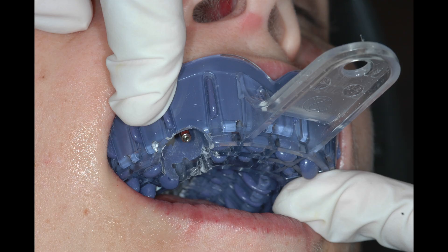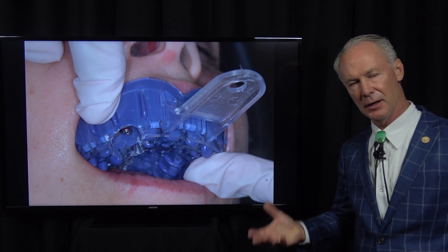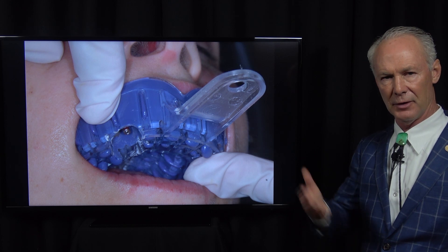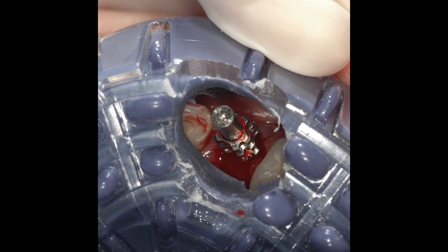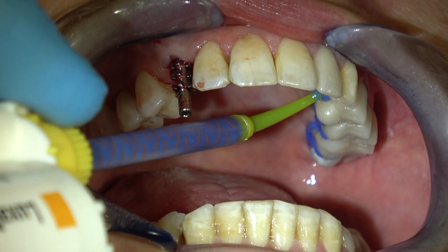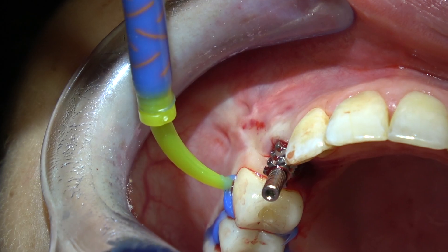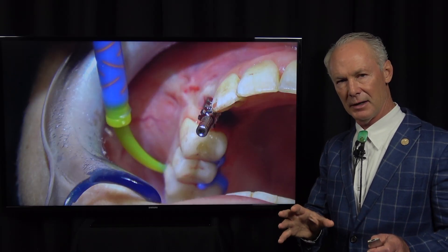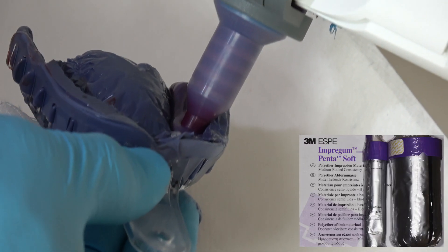We have a hole in our custom polyether tray. You can do a closed tray impression — I'll show quite a few Dental Minute videos on that in forthcoming episodes — but this is an open tray, and you can see the impression coping sticking through the hole. This is Luxabyte block-out material. This polyether is so rigid that if you don't block out the interproximal holes between the teeth, it can lock in. So be sure to place this material before you take your polyether impression.